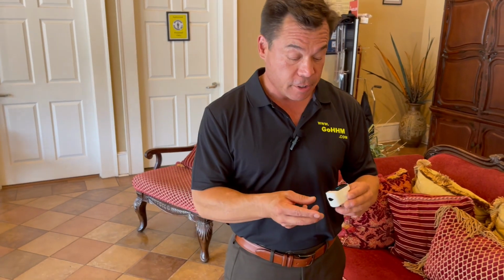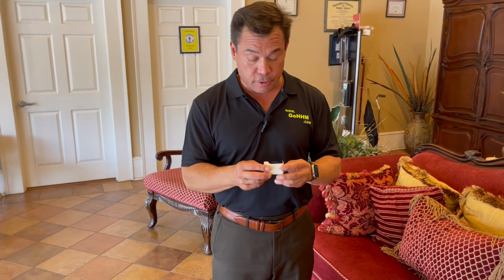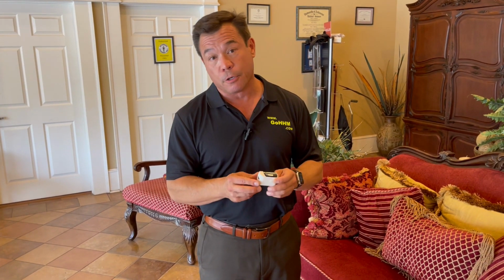We hope that this has helped you out. You've probably seen a lot of these during the pandemic, and now that the pandemic's over, you're not seeing them as much, and everybody's got these, but these are very useful within the home if you've got somebody that's on oxygen, maybe using a CPAP and having troubles with the CPAP at night, or somebody that has a nebulizer or asthma or COPD. This is very useful to keep in mind. It's better than waiting till somebody has blue lips and you know that they're low on oxygen.